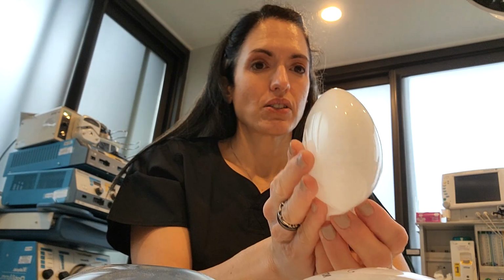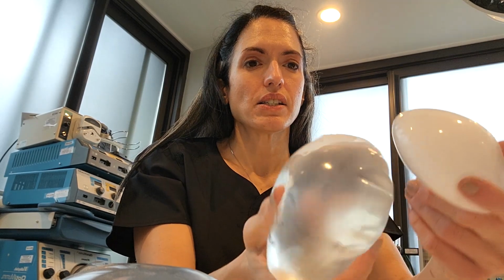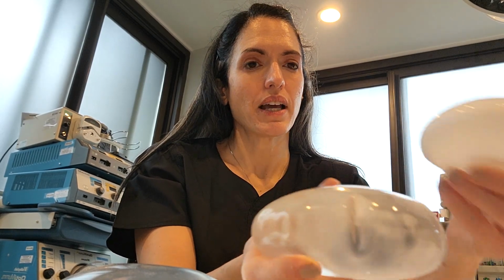The difference when it's in the patient, the ideal is going to have a little more upper pole projection, whereas the saline, depending on the projection and depending on how the implant is structured, is going to have a little bit less of this kind of pyramidal dome shape. Trade-off as usual with everything. The ideal is a narrower implant and a taller, or when it's on you, more projecting implant, so the contour is going to be a little bit different. But in terms of saline and silicone, these are the two main categories.